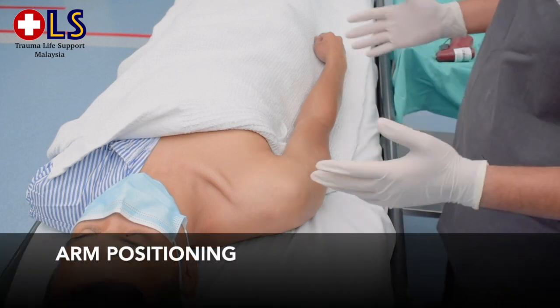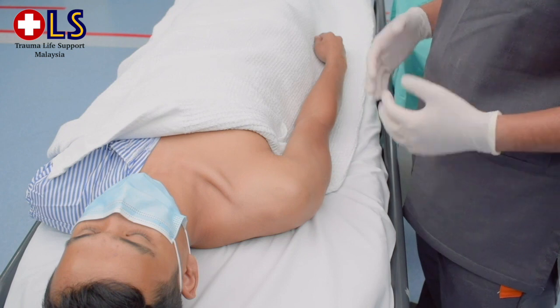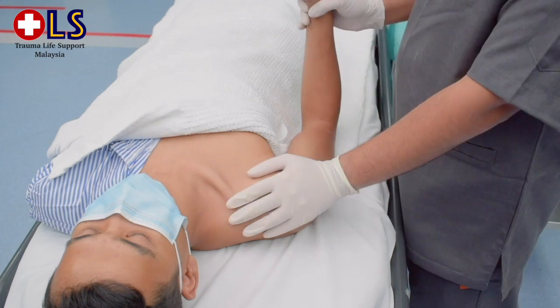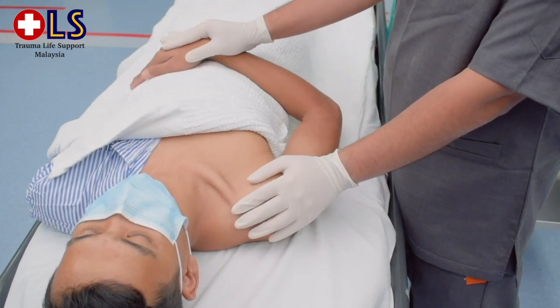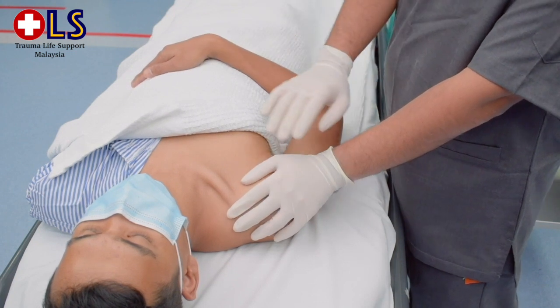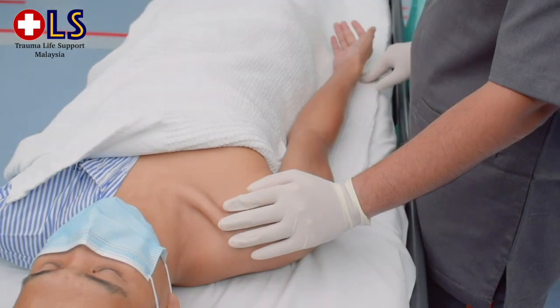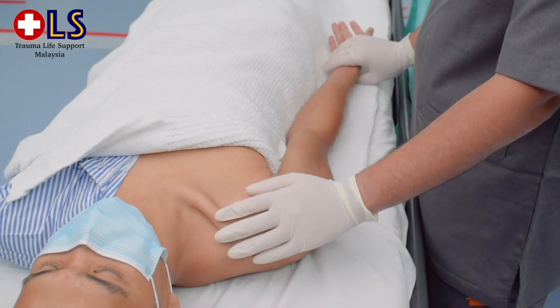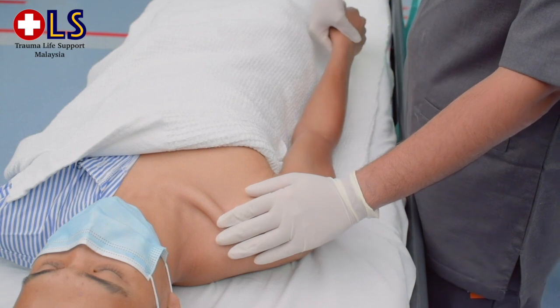There are several ways to position the patient's arm and identify the landmark for insertion. The recommended way is to place your palm on the patient's shoulder anteriorly, then place the patient's hand over the abdomen by adducting the elbow and internally rotating the humerus. This will move the biceps brachii tendon away and expose the large area of cortex of the greater tubercle. The alternate method is by placing the arm tight against the body and rotating the hand so that the palm is facing outwards and the thumb pointing downwards.